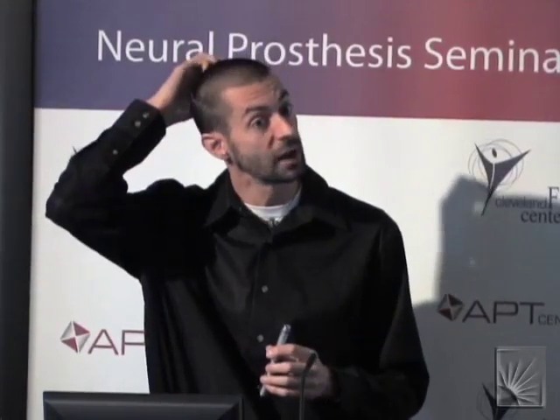So far, your results seem to be the effects of using a single contact. Have you explored the possibility of using multiple contacts in different locations, for example? No, we haven't, not in this study, and at least not from a clinical application. We wanted to start with the most simple, and most patients are programmed clinically with just stimulating at one contact as well. So the idea was, let's start simple, and we can move towards more complicated or elegant stimulation strategies in the future if it works out.